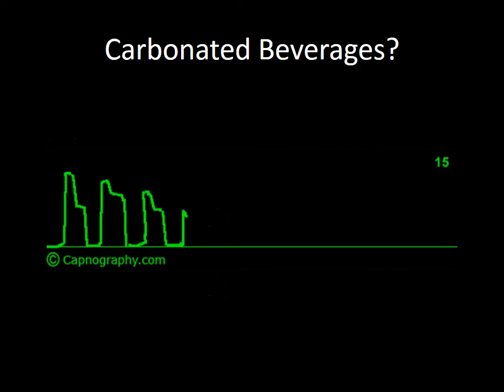What about carbonated beverages? Remember that we get these nice waveforms based on the carbon dioxide coming out of the alveoli. So let's say hypothetically you did have a patient that arrested right after they drank a soda, and you got there and you stuck the tube in the belly rather than the trachea, and you did have some sort of CO2. The point is that you probably wouldn't have a nice box waveform.